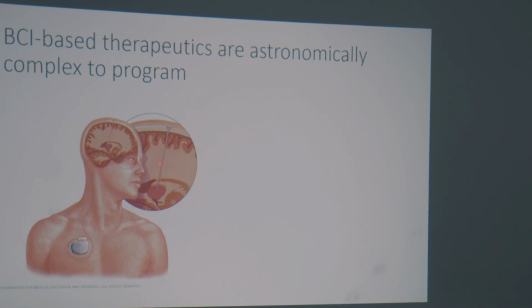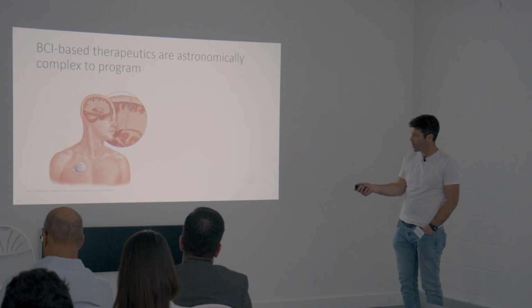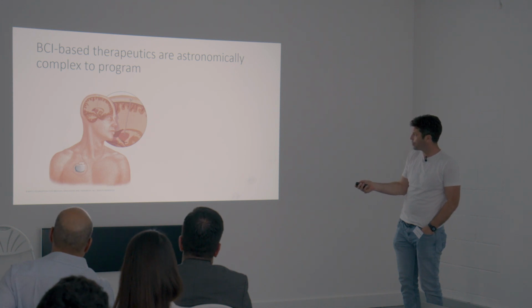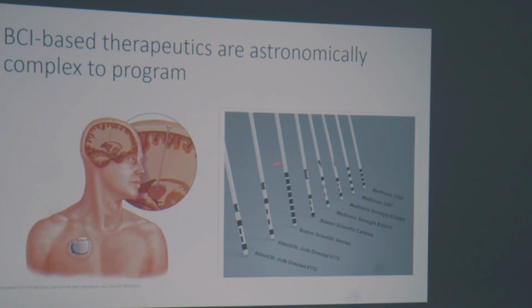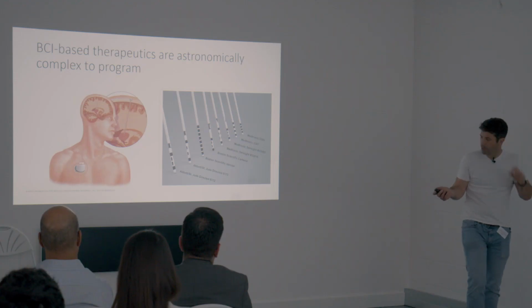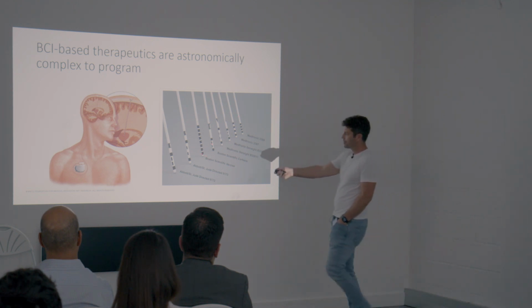And you can't get a very good look at it here, but it's actually quite a complex structure to the electrodes that are put into the brain, as you can see better here. These are all of the commercially available deep brain stimulation electrodes, and the black is essentially the contacts where they're electrically active, or at least interfacing with populations of neurons. And the thing to appreciate about this is the possible combinations of stimulation parameters that you can have here are absolutely phenomenal. This is a modern lead.